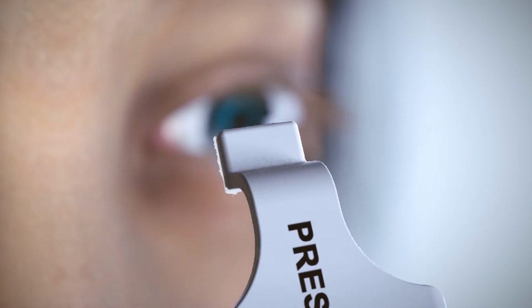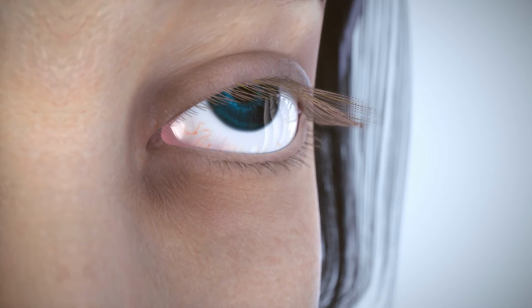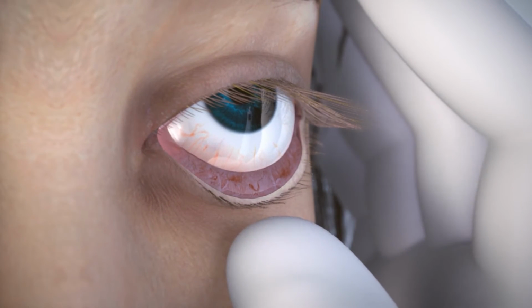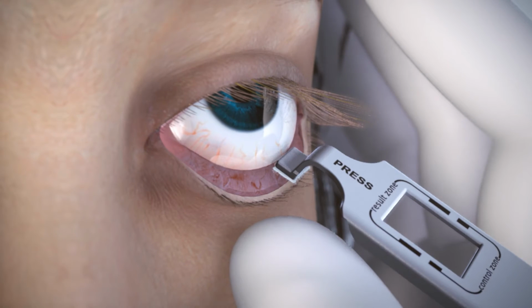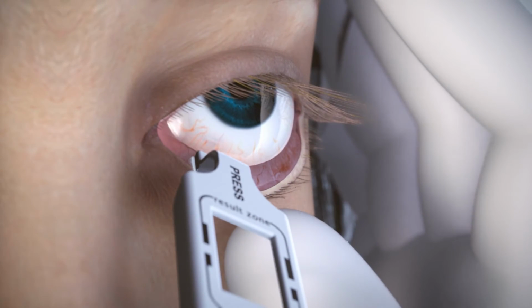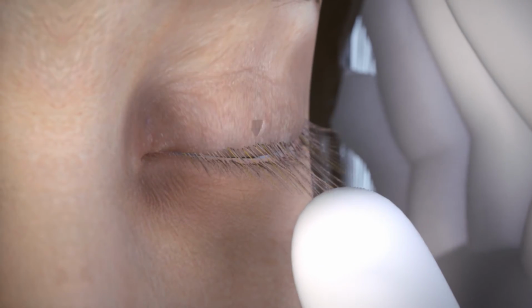Locate the sampling fleece on the underside of the sample collector. Instruct the patient to look up and gently lower the eyelid to expose the palpebral conjunctiva. To collect the tear sample, dab the sampling fleece in multiple locations along the conjunctiva, releasing the lid after every 2 to 3 dabs to allow the patient to blink.